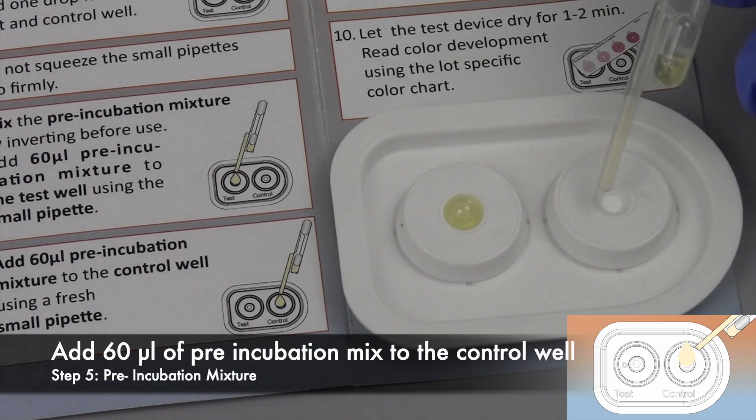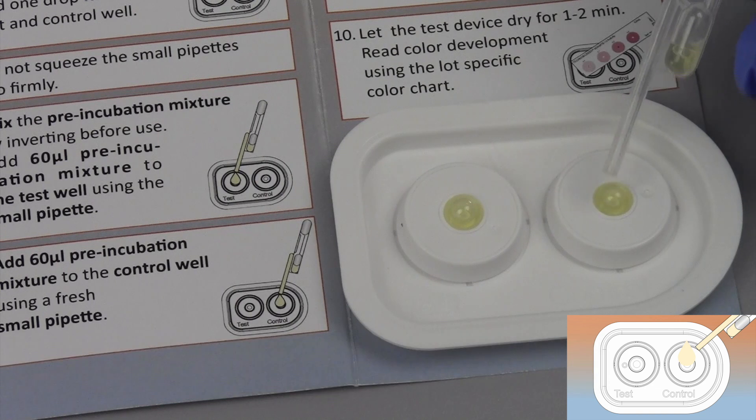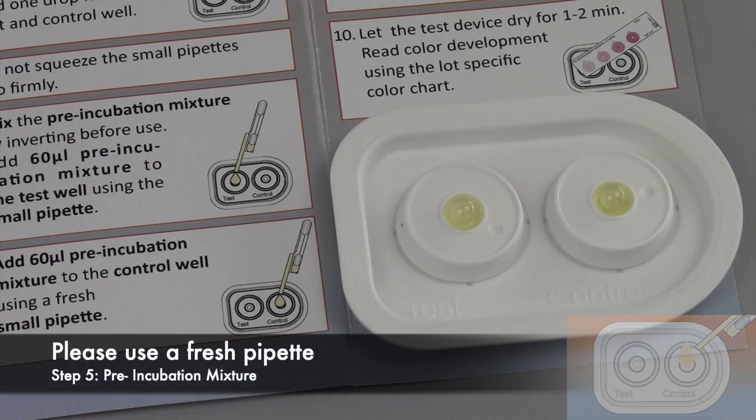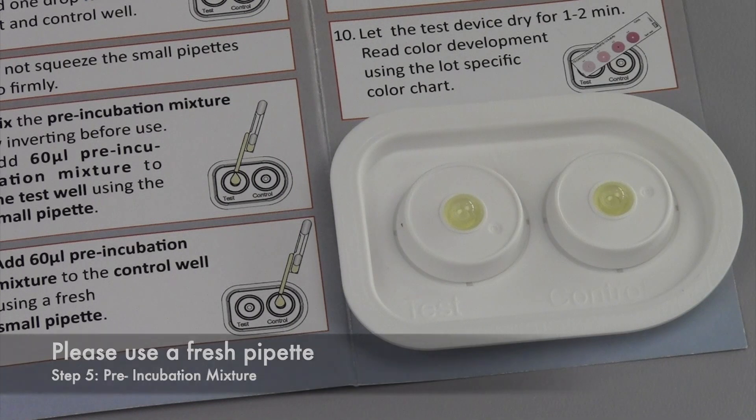Thereafter, add 60 microliters of the pre-incubation mixture to the control well. Please use a fresh pipette.